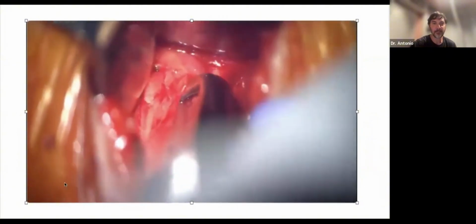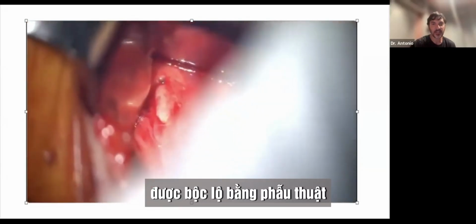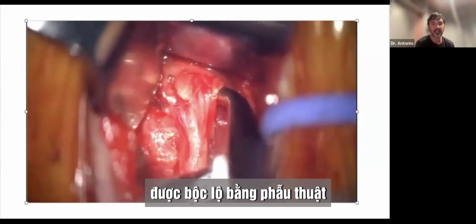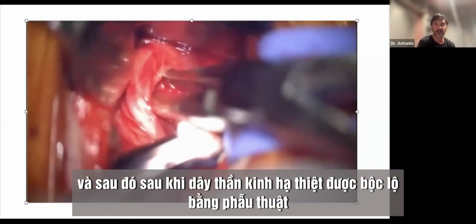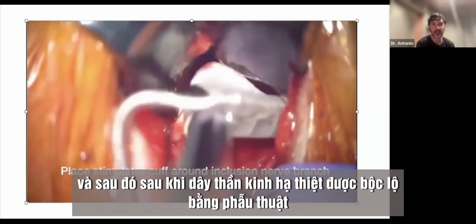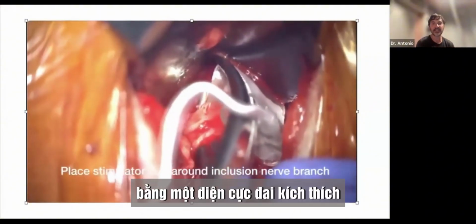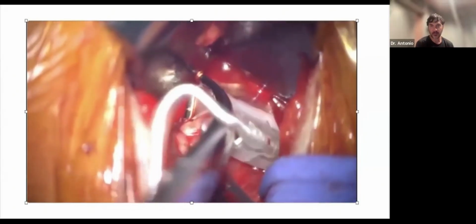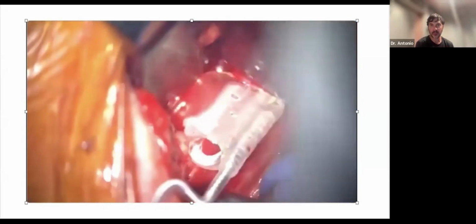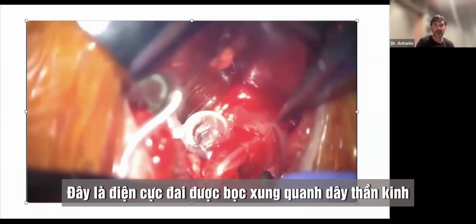The hypoglossal nerve, as you can see here, is surgically exposed, and then it is isolated and wrapped with a stimulating cuff electrode. This is the cuff electrode that is wrapped around the nerve.